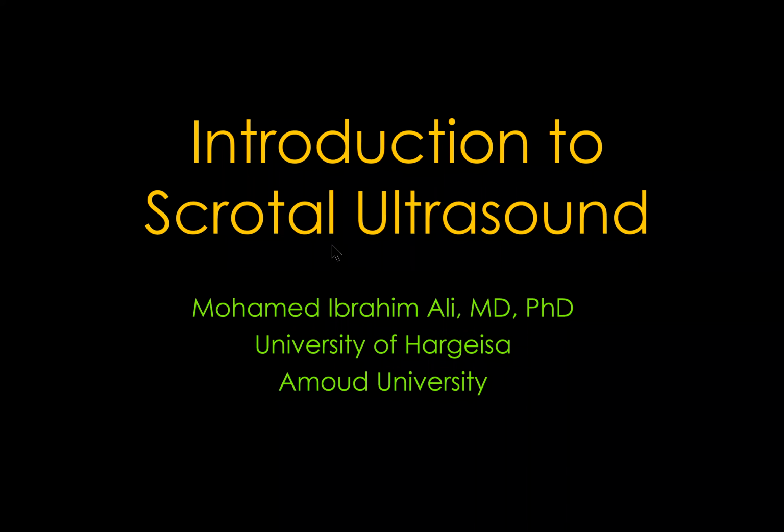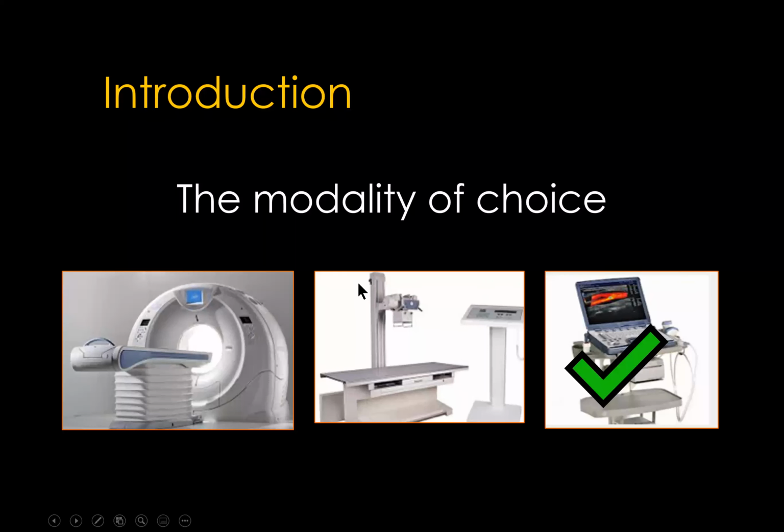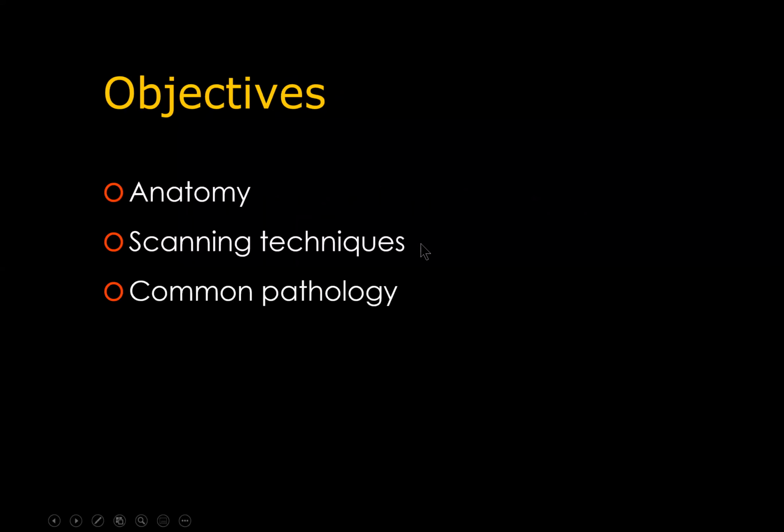Today I'll talk about introduction to scrotal ultrasound. Ultrasound is the modality of choice for evaluating the scrotum. Despite the more sophisticated imaging modalities, ultrasound remains the first line and frequently the only imaging modality used in the assessment of scrotal abnormalities. I will discuss the anatomy of the scrotum, scanning techniques, and common pathology.